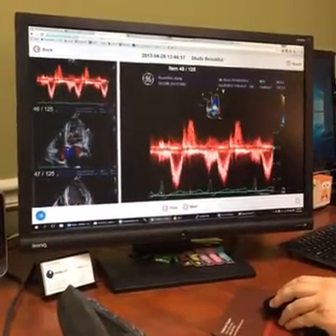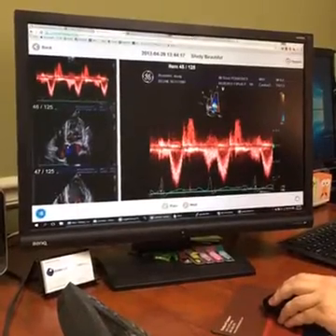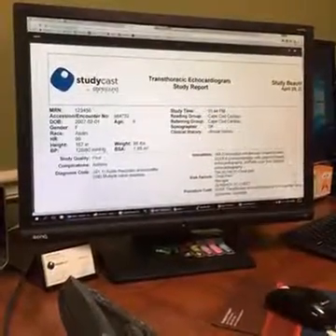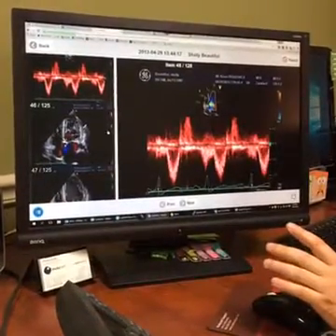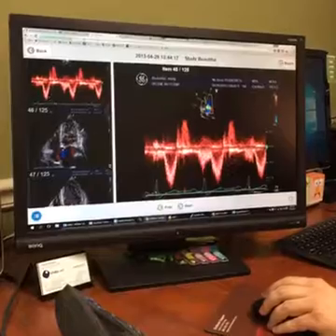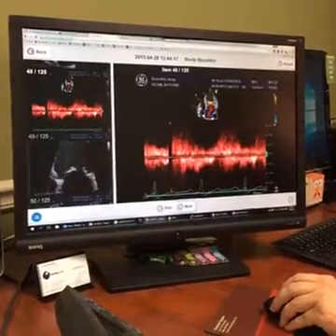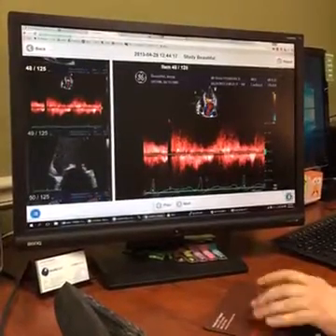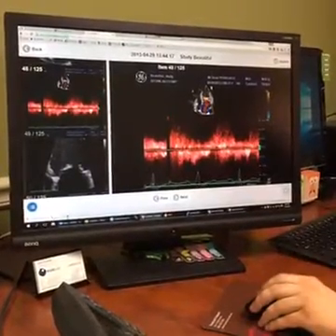There is also up here in the upper right a report icon. So if you wanted to view the final or preliminary report for this exam, you could open that up and it would open the PDF for that particular exam. One other thing that's nice is sometimes doctors might want to use images — particularly for research projects and presentations. So if you share an exam with them, down in the lower right there's a save button. If you wanted to find a particular image or clip, you could click the download button and it would download that clip or image to your computer, and you could drag it into a presentation or whatever you needed to do.